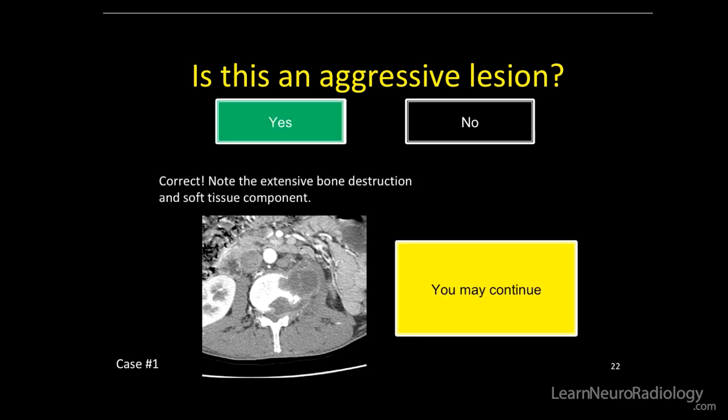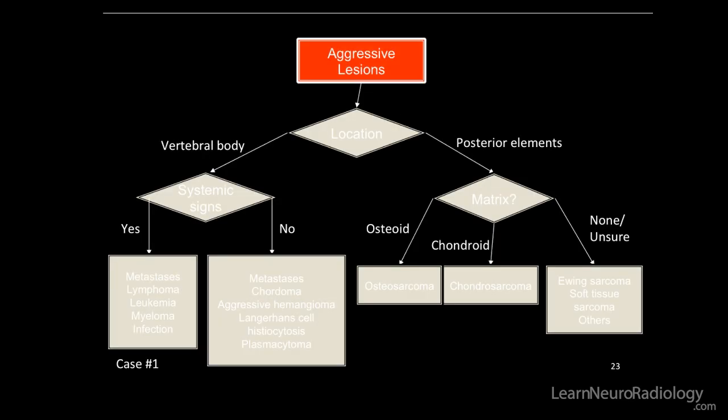It's an aggressive lesion. There's extensive bone destruction along the posterior and lateral margin on the left, and there's also an extra-osseous soft tissue component.